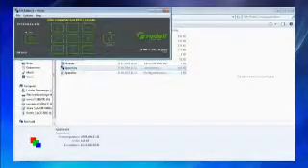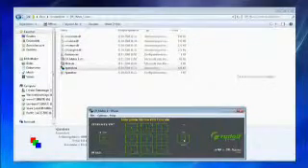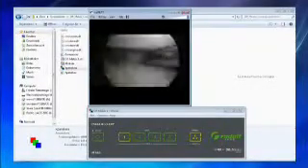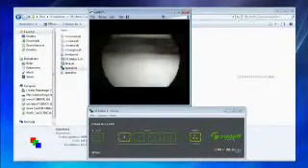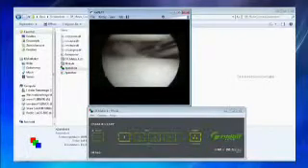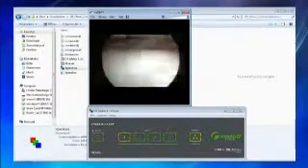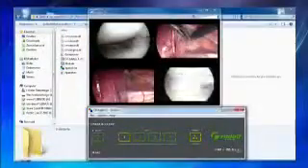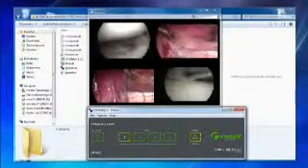By activating the network stream from the operating theatre, it's possible for authorized users to access the OR matrix and the video signal provided by the operating theatre with the stream client supplied after the approval of the operating team. By entering the PIN code, which can be changed individually, it's possible to use the device's remote control function and to make a selection of the image sources available. For example, Image 1, endoscopy camera. Up to 4 operating theatres fitted with the OR matrix can be monitored simultaneously.